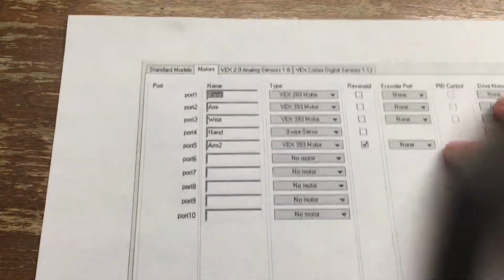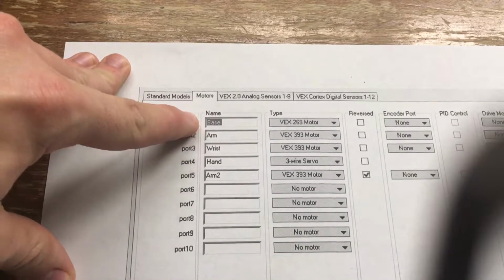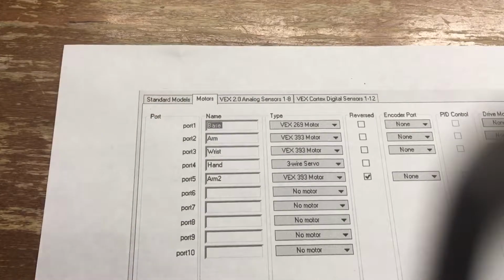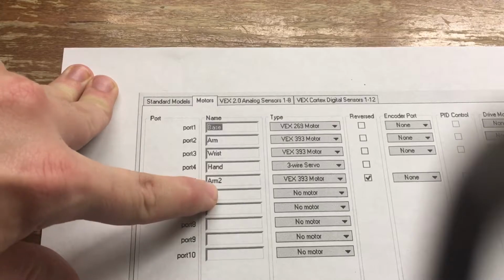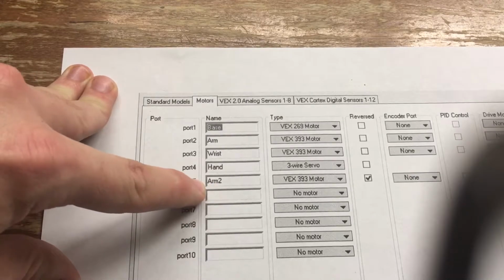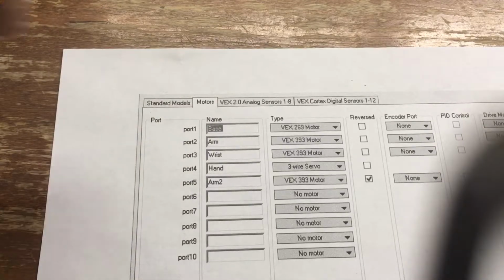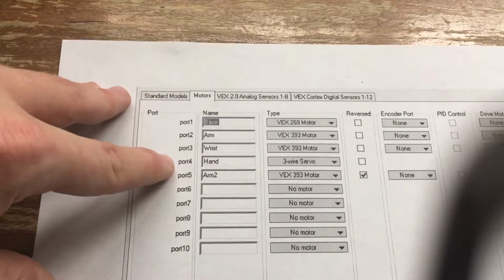Our coding is pretty simple. The only thing we have is some motors to program in. In port 1 we have the base motor, which powered those gears. Port 2 is the arm, which powers the chain and sprocket. Along with port 5, which we added in later, is arm 2, which is the second 393 motor that powers the arm. We have a wrist, the 393 motor that drove the wrist, and the hand, which is a 3-wire servo, which is the one that opens up the claw.